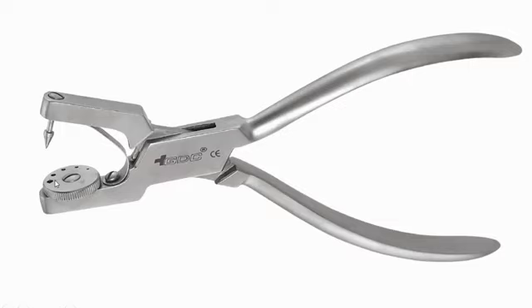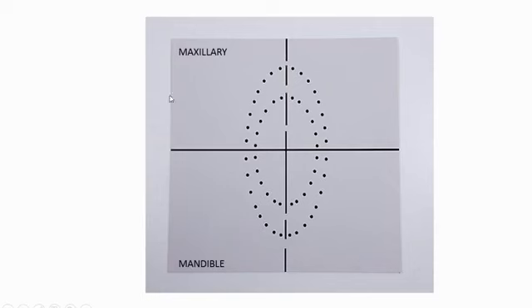You just need to press from here and you just need to put your rubber dam sheet, और होल करना है जहां आपने टेम्पलेट पे मार्किंग लगाया था, तो टेम्पलेट के ऊपर आपने रबर डैम शीट रखी. वेरी सिंपल. You just mark a hole for which tooth you are isolating. If single tooth, just mark single. If multiple teeth, mark multiple.